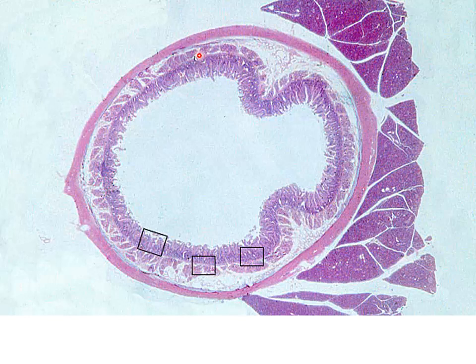So even at this low magnification, we're a little bit curious that this is likely going to be Brunner's glands because we're in intestine. Plicae circularis tells us that. We're not in colon because we don't see all of the white goblet cells. So that's how we can deductively reason that in this low mag cross section we're looking at duodenum.